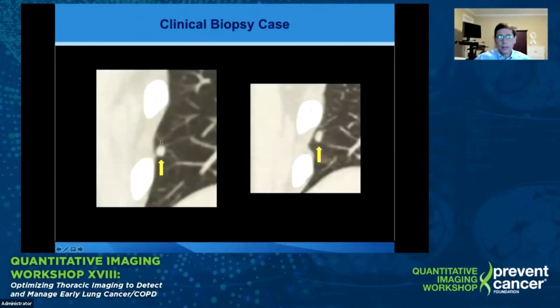And we've seen this clinically. This is time 1 on the left. It's time 2 from Mount Sinai. They got a case with this type of scanner, and you can see that this was referred for biopsy, but it turns out that this is not growth of a nodule from this time point to this time point. This is actually just spatial warping of a CT scan due to the scanner itself. So fortunately, this was caught and the biopsy wasn't done because that would have been unnecessary.